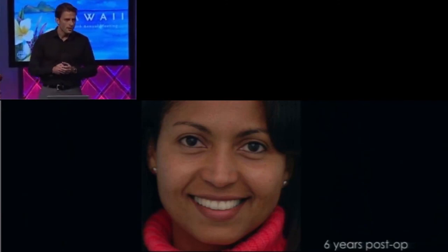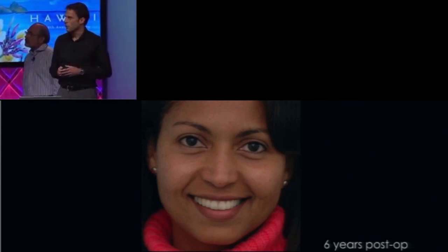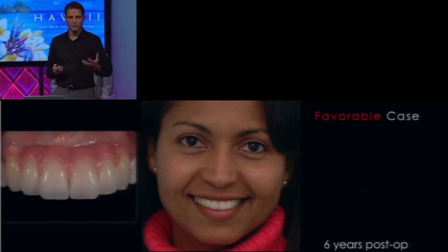So when they come to me saying, we need something else, surgical reconstruction by itself is not anymore the best option for our patient, that's when we come into play, and we started to create some options to really fulfill our patients' desires and expectations. And we know that aesthetic expectations nowadays are increasing a lot. So I think the main factor is to go through the decision-making process and to try to plan in advance. And the first point is to analyze the case and see if it's a favorable case for artificial pink or not.